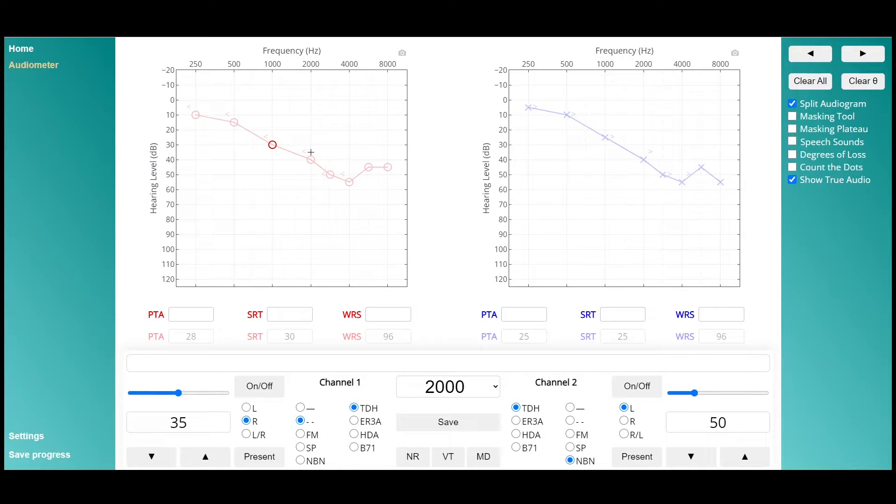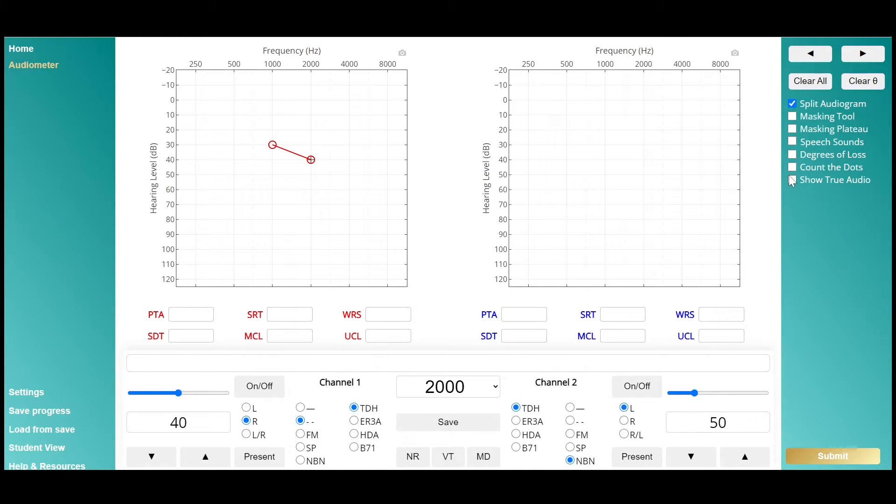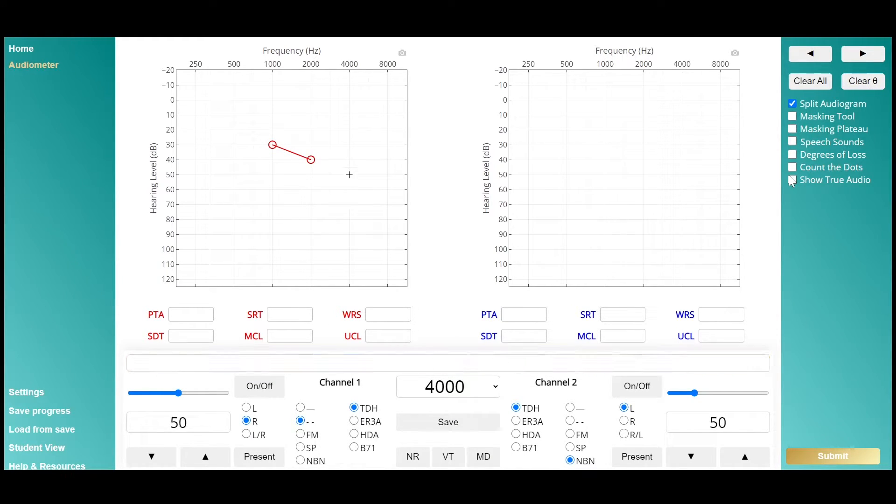In practice mode, you can toggle the true profile on and off to check your progress as you go. In exam mode, these features are locked to test your skills from the beginning to the end of testing.